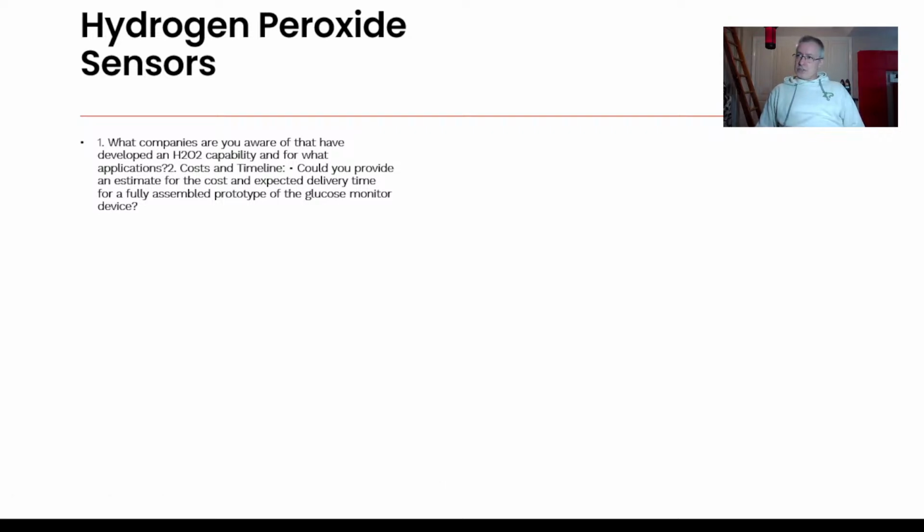Just out of interest, so hydroperoxide detection. In fact, ZP does have a client on the market doing hydroperoxide detection. They're doing it for inflammation of the lungs, in COPD, chronic obstructive pulmonary disease. So ZP, it just occurred to me now, I was wondering how I was going to answer this question, and it just occurred to me that ZP does have a customer on the market. In fact, I'll just grab their device now.